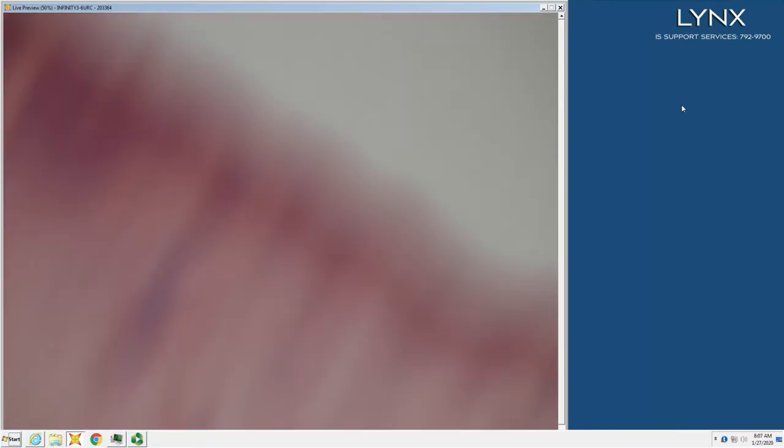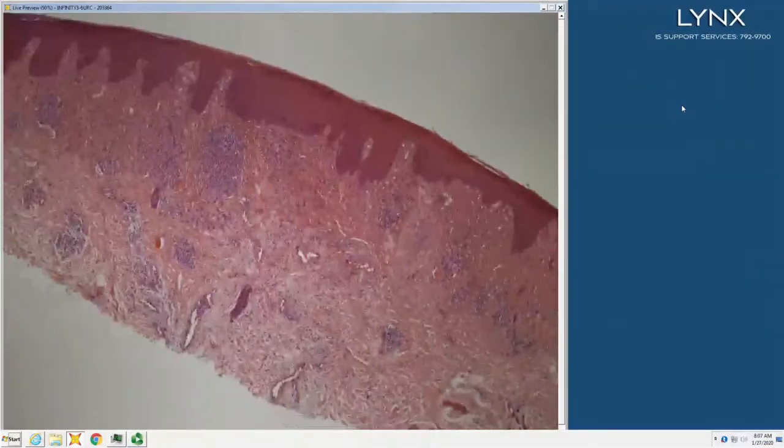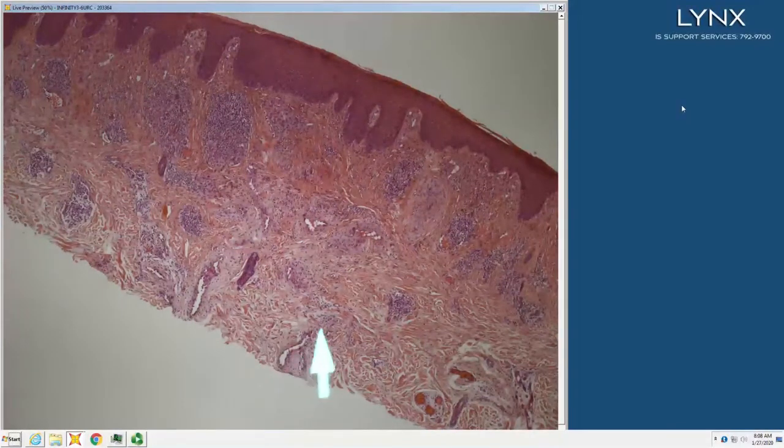Let's see. This is a good one. So, quite a bit of information. Almost clustered. Quite a bit of inflammation, and then also the vessels too. And tell me about the endothelium. Hobnail.